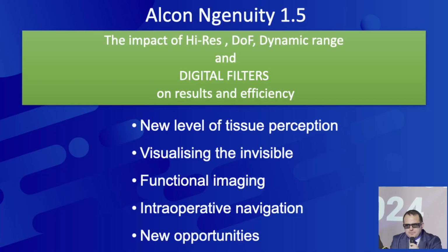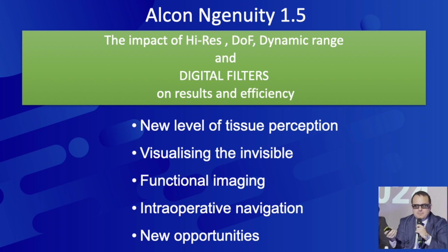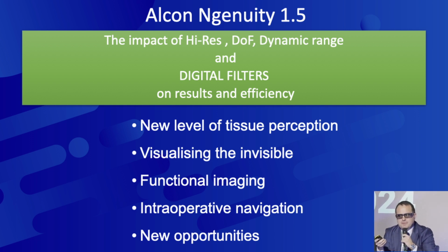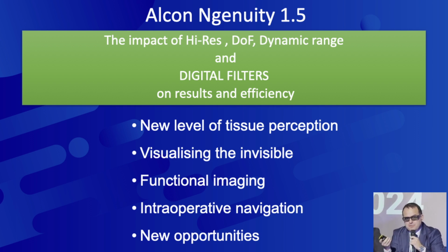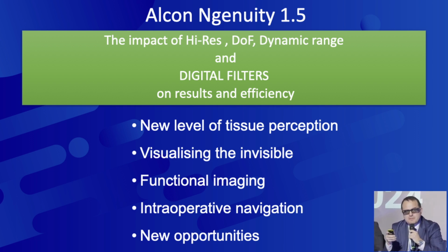So if the impact of the high resolution, increased depth of field or dynamic range, and especially my favorite digital filters, are they changing the level of our performance? We might have a new tissue perception. We might visualize what we cannot see, for example, the vitreous. We have a functional imaging, fluorescein angio. We have intraoperative navigation, and the field is open for new opportunities.